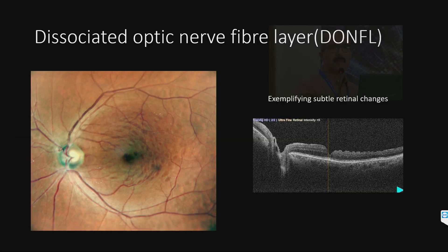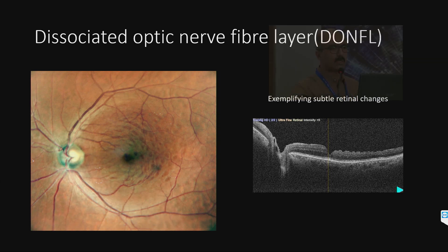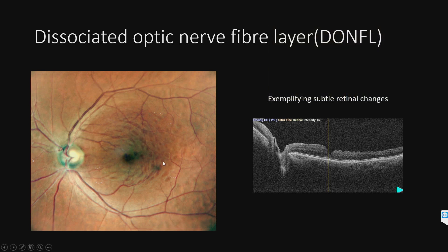This is an unhappy patient who came after macular hole surgery done elsewhere. Vision was 6/9 but he's unhappy. Subtle changes in the retina are picked up better with multicolor imaging — you can see the weft-shaped retinal nerve fiber layer dissociated area, called a DONFL.